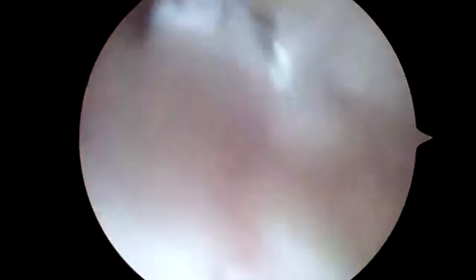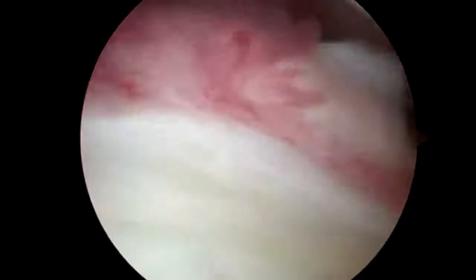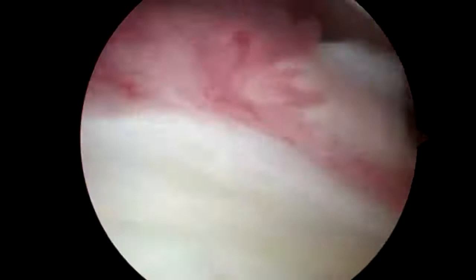Now I'm 360 degrees around. You can see it release the shoulder — there's the space. That's how it's supposed to look. Now you see the ball and the socket separated. That allows motion and translation so that afterwards when I go to therapy, the shoulder will move. You see all the residual inflammation that I will shave out. Looking all the way around the shoulder, now there's space. You can see the degree of separation we've been able to achieve arthroscopically. All done.